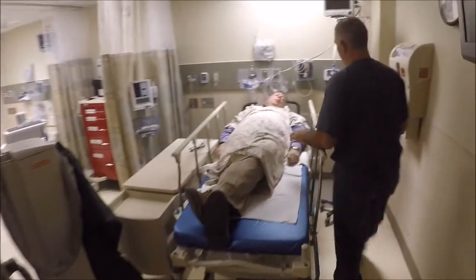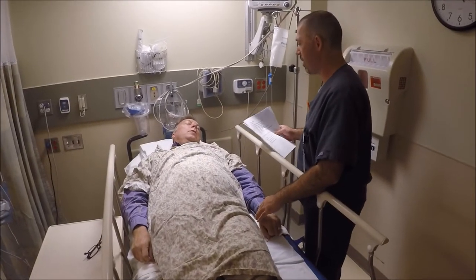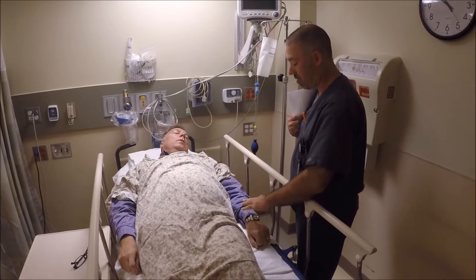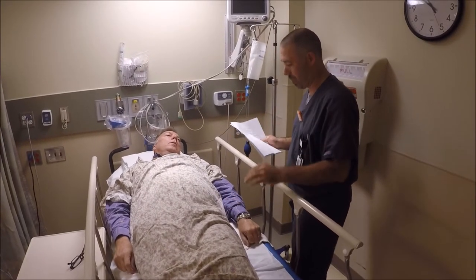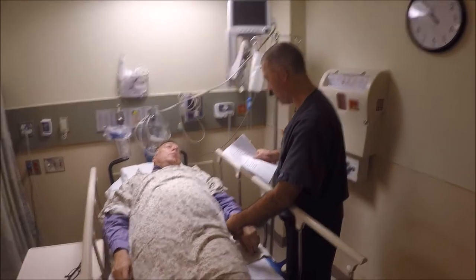Hello. Hi. Kevin Evans? Yeah, yeah. My name's Seth. They asked us to come get a portable chest X-ray on you here. I'm just going to check your wristband to make sure all my numbers match up here. Okay. All right. Everything looks good here.